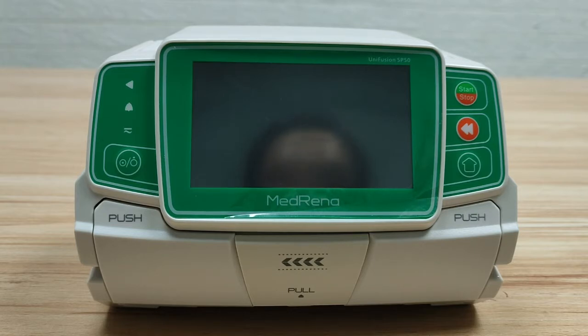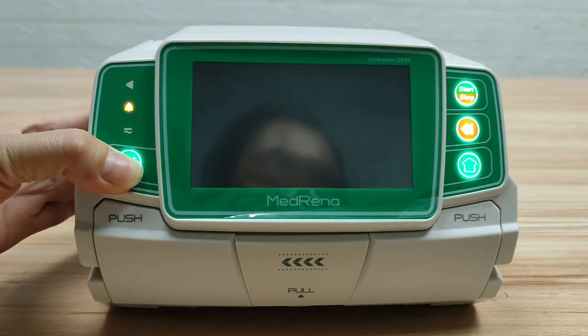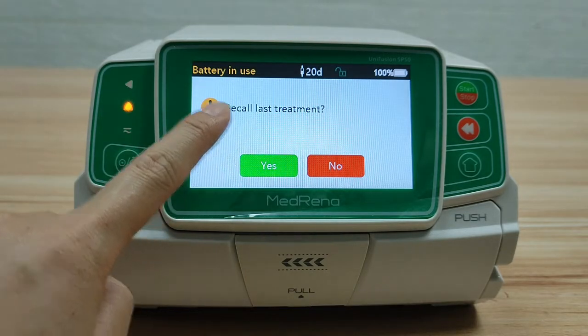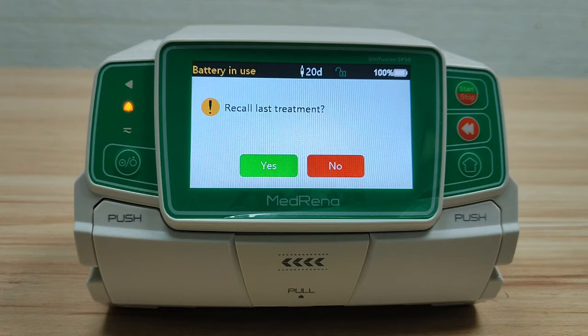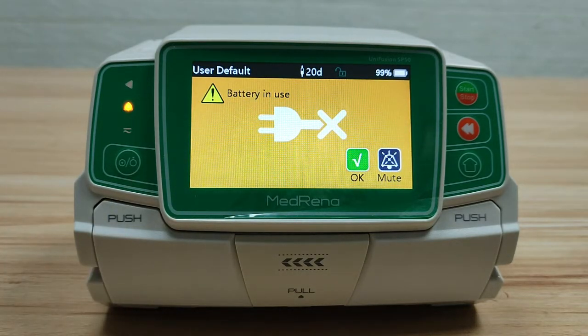First step: switch on the pump. Press the power button for two seconds to turn on the pump. The pump prompts whether to recall the last treatment. Selecting No will clear all remaining data of the previous infusion. Selecting Yes will pick up the settings of the last infusion, saving time if you just need to apply the last infusion parameters. Now we select Yes. The pump prompts 'battery in use' to remind that it is not connected to AC power supply. Press OK.